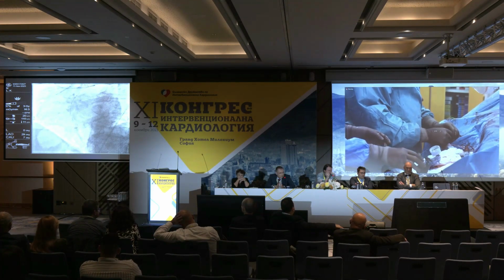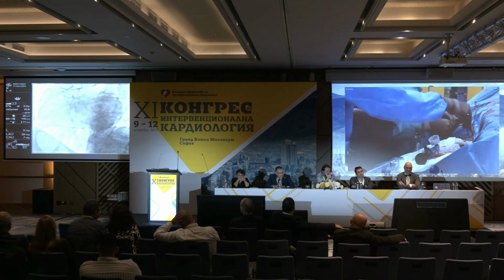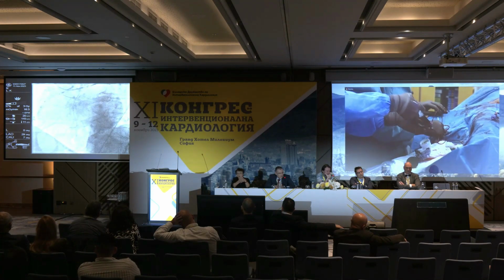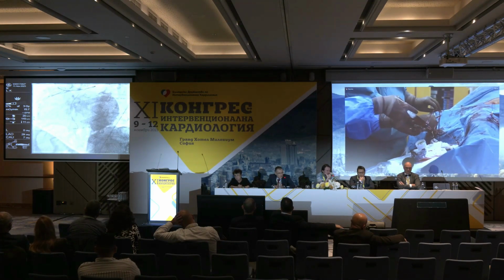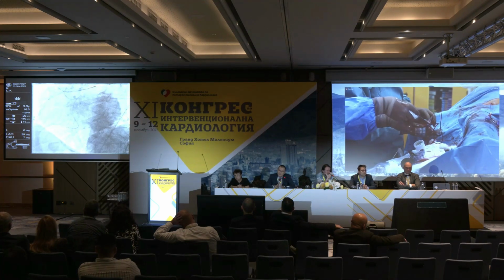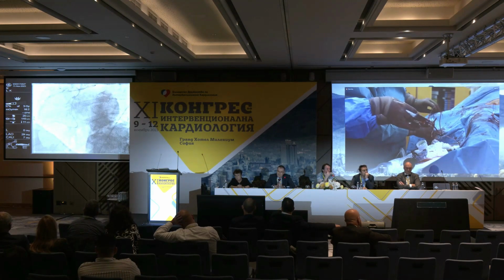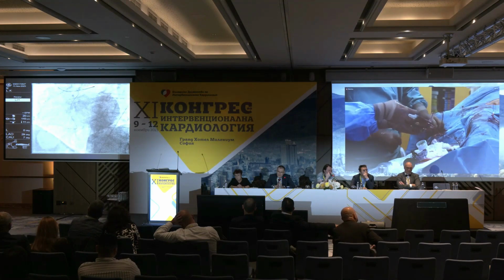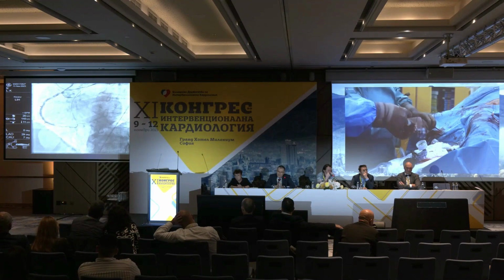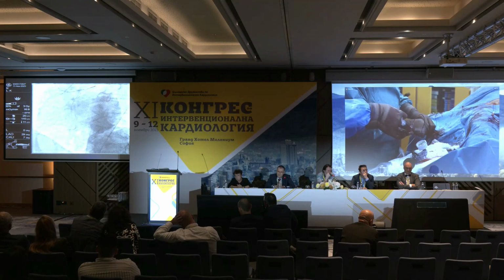Valery, you measured that probably at that point it's... Let's not finish with perforation. So what? Oops. Oh, that's interesting, huh? You saw. It happens, yes. But my point here is, why don't you try with something larger? I'm a little bit concerned that the 4.5 will not be enough. We need to go more proximal. We will IVUS it and we will see.